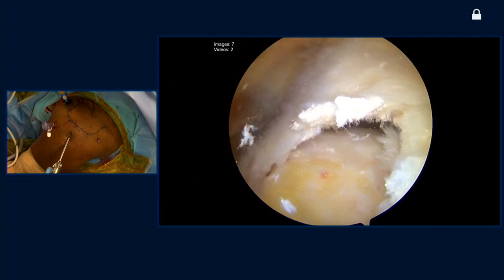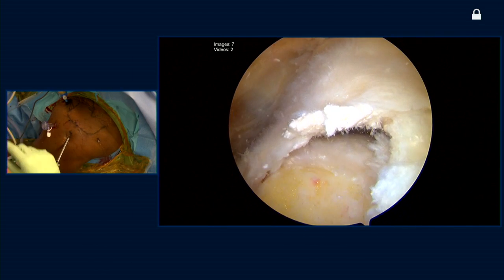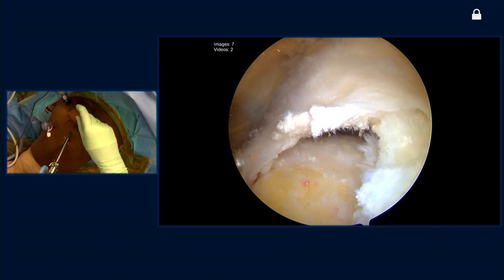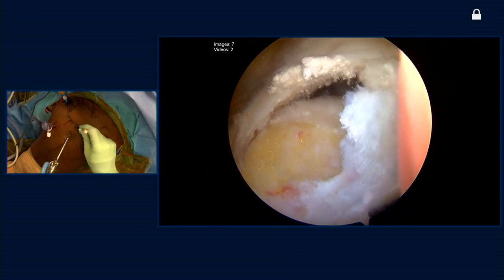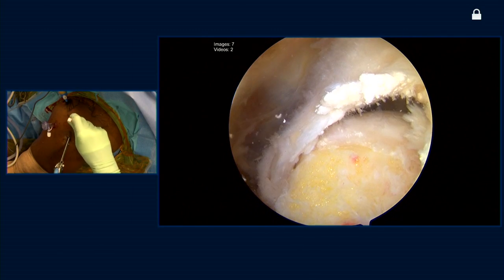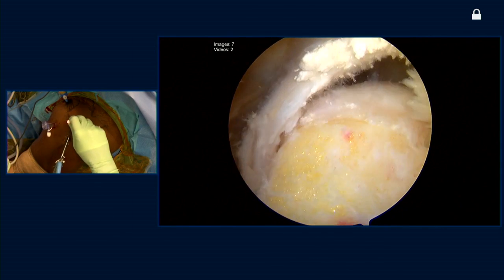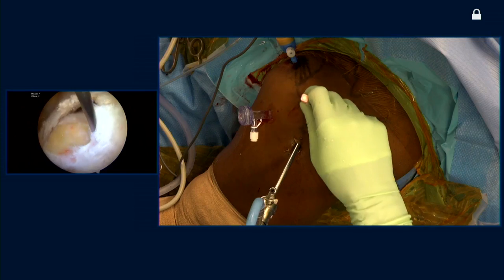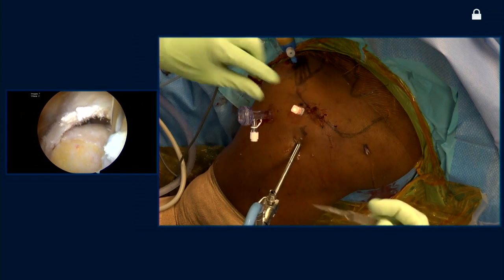The first thing I'm going to do is target my lateral portal, which will allow me to put in my anchors. We're going to come just off the edge of the acromion to see what that looks like in terms of placing our anchors. I think we're going to be right in this zone, and this will allow me to place one anchor anteriorly and one anchor posteriorly. Then my plan would probably be to use a cinch stitch in the back to try to deal with what will likely end up as a small dog ear.